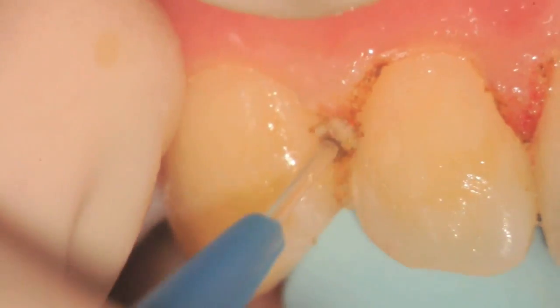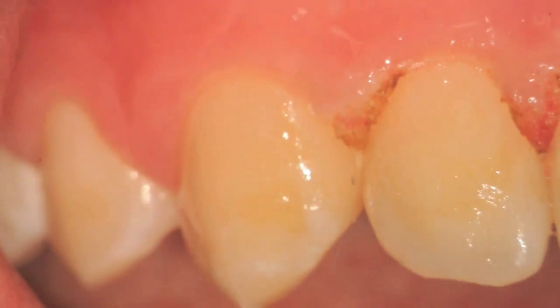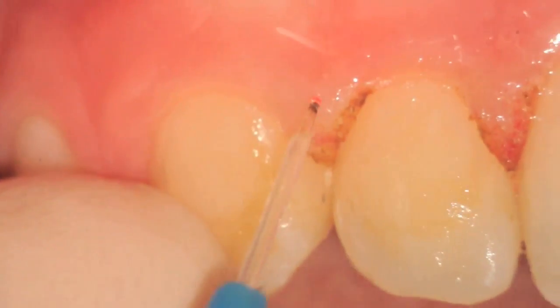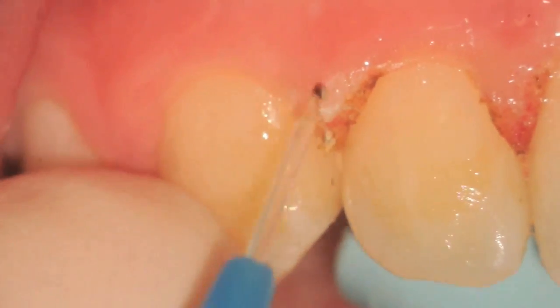A wet gauze is all you need. You can see here that we're not only working on the papilla itself but we're trying to de-bulk it with short brush-like strokes to remove the epithelial layer.